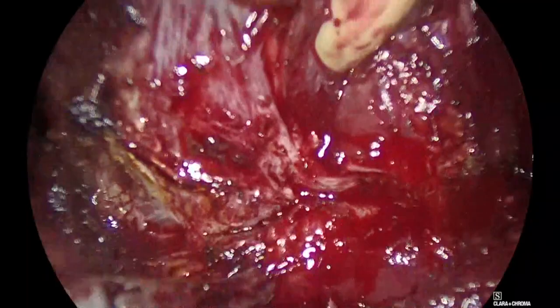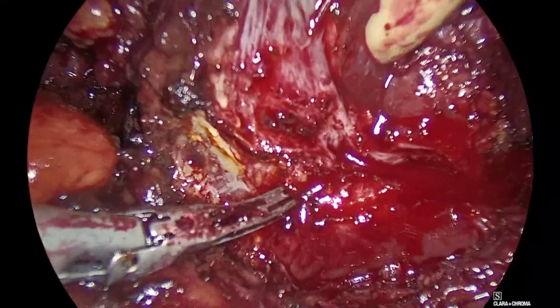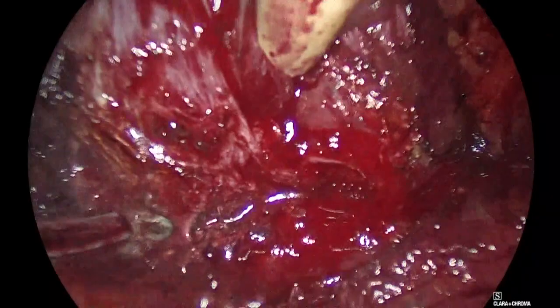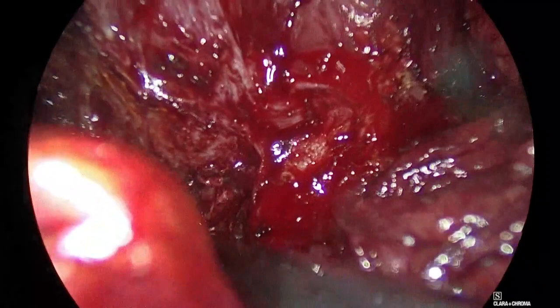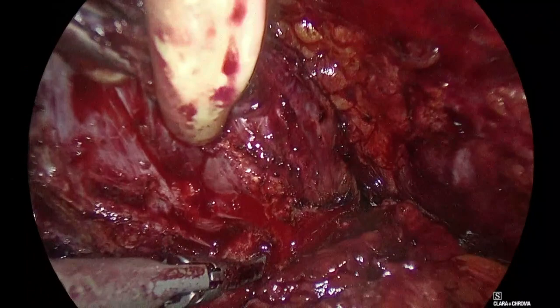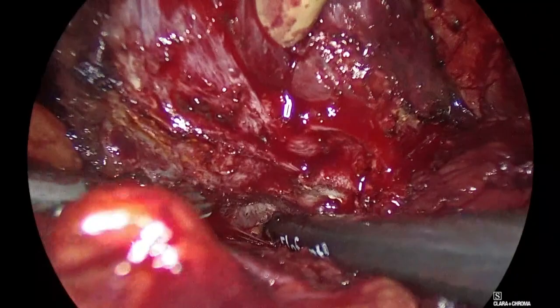Good. So being here, having my field from here and pulling out the prostate, I can nicely go in deep centrally now. Close to the bladder. And I'm pulling out the prostate. Go in here, Panagiotis. Good, pull it down. You see that I'm in the right plane here? Here's my plane. Go in here, Panagiotis. Padeli, not you, Panagiotis. And now I can extend my cut. It's always easier on my side to find my planes because this is the side I'm working in. Okay, good.